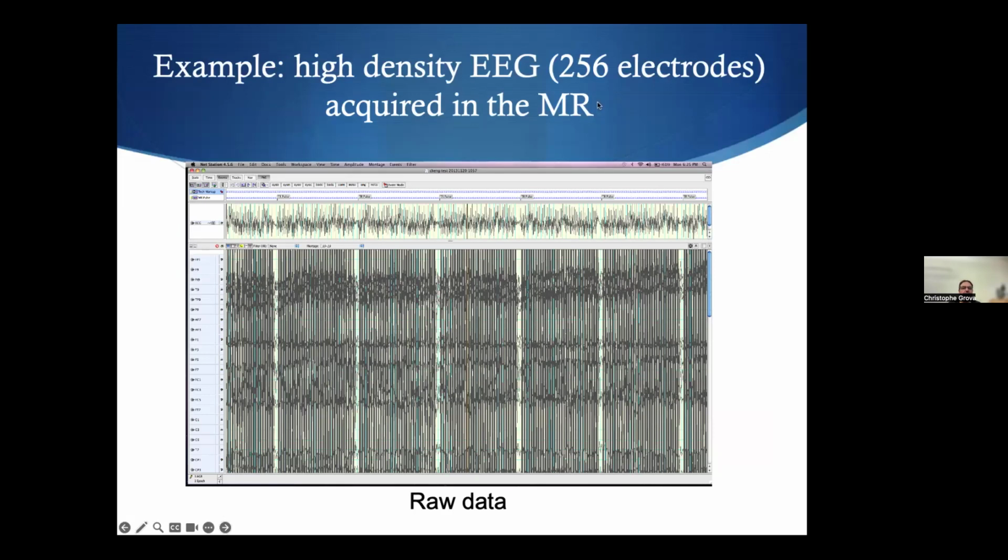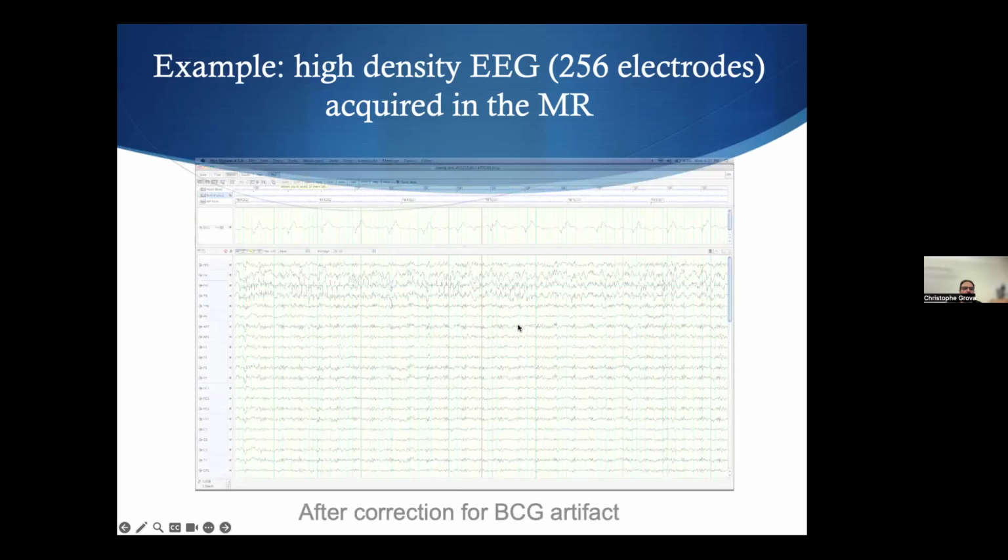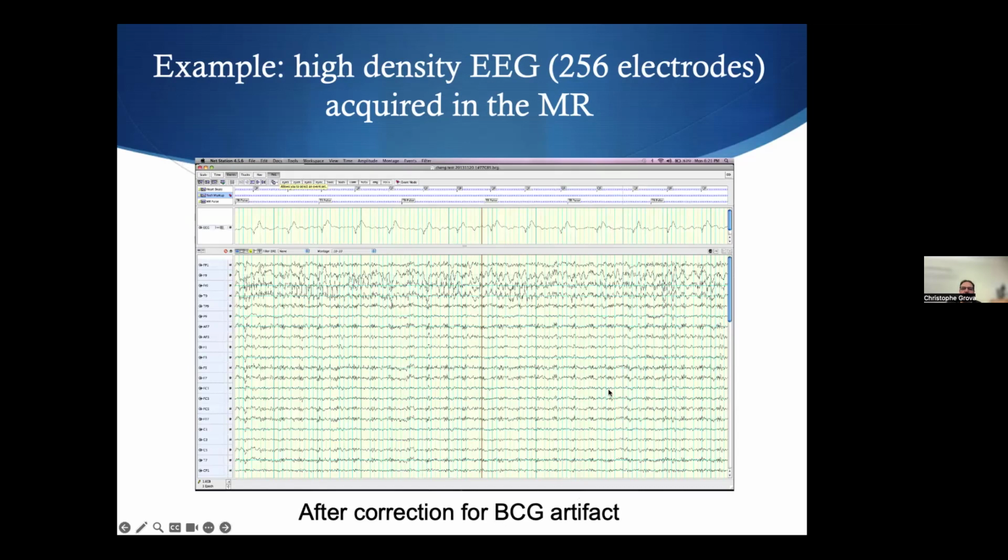So let's look at some real data. These are EGI data acquired at Perform on the 256 system. This is the raw data during an EPI sequence, so of course you don't see much. We're going to remove the gradient artifact. I'll show you in a minute the gradient artifact, because it's so reproducible during a specific amount of time, because everything is nicely synchronized. You just create a template, you average the template, and you remove the template. And then you start seeing this ballistocardiogram at every heartbeat.